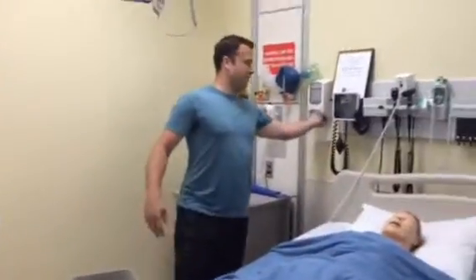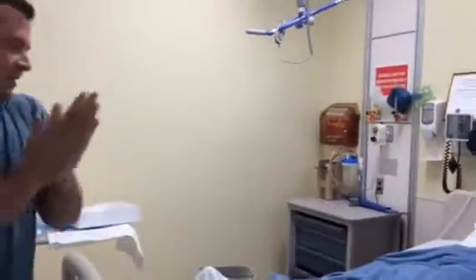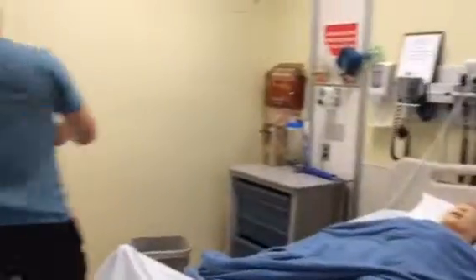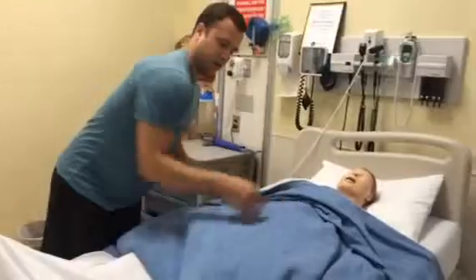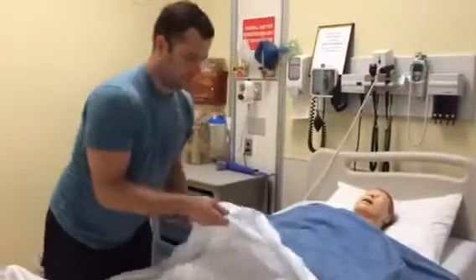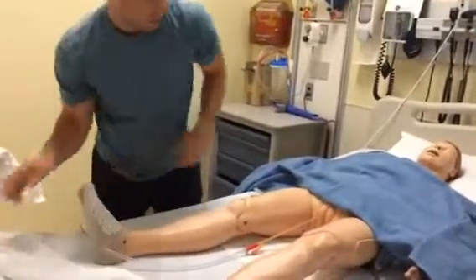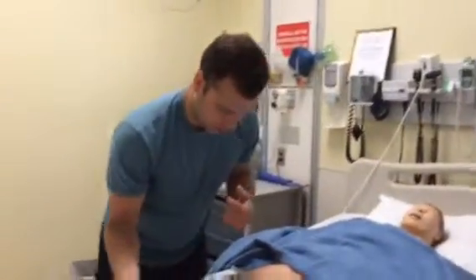Knock, knock. All right, ma'am, you ready to take your Foley catheter out? So let me don some gloves. At this point, I would put on gloves. And so I'm going to lift this up and pull this down. And I would have a towel underneath here, as well as gloves on my hands.